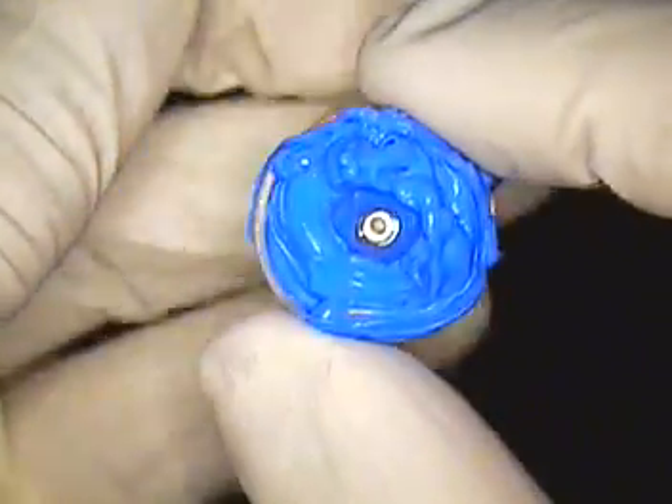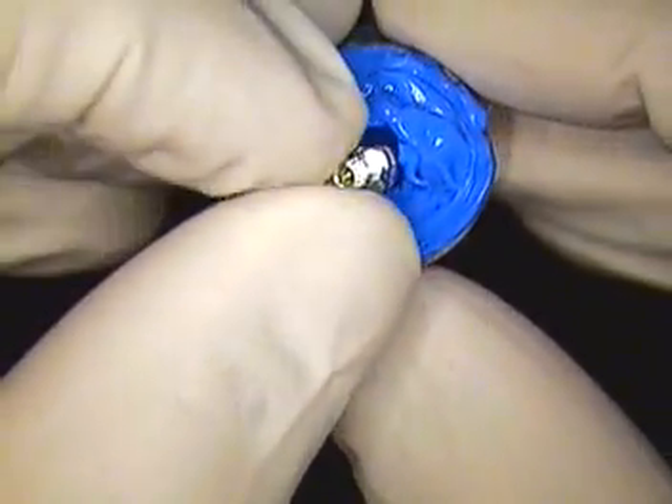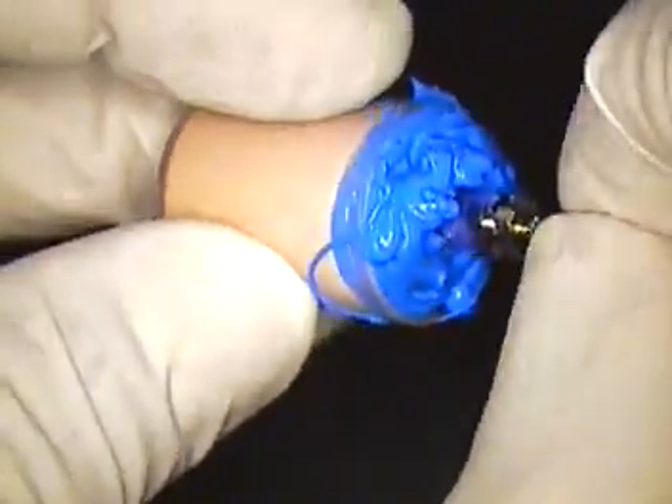Now that this material is set, we're going to slide in our impression coping, and we're actually going to inject in and around that area.